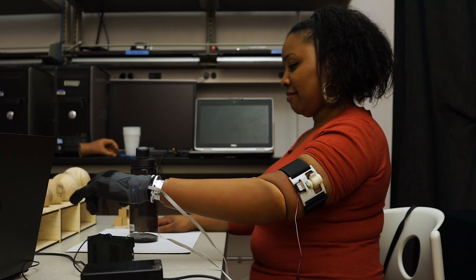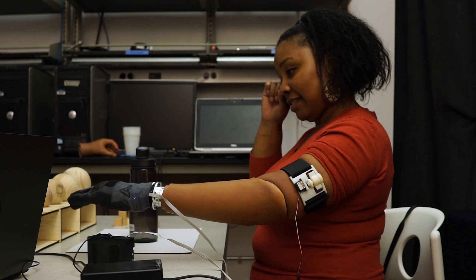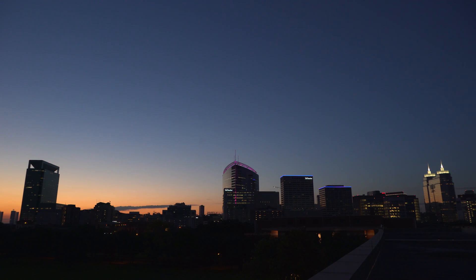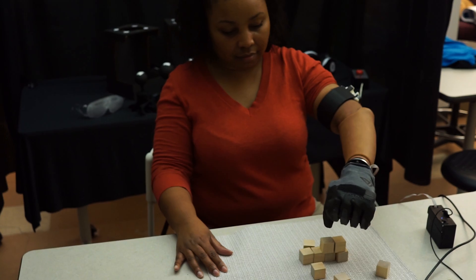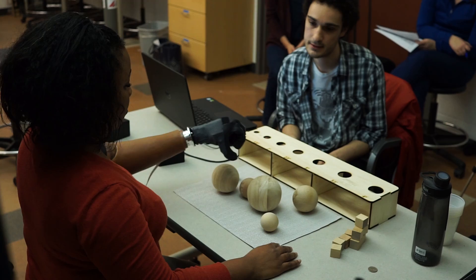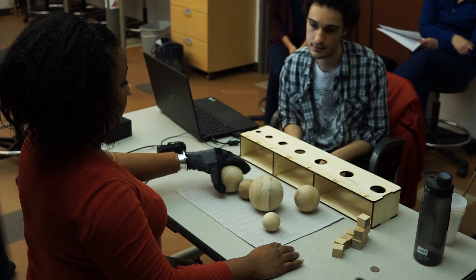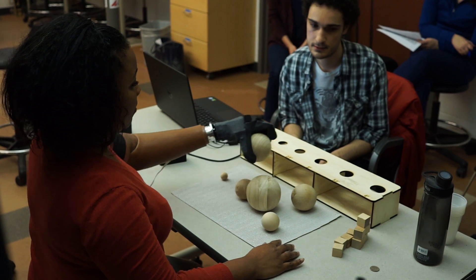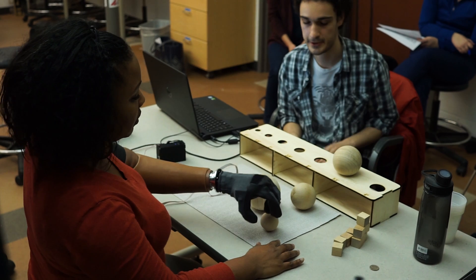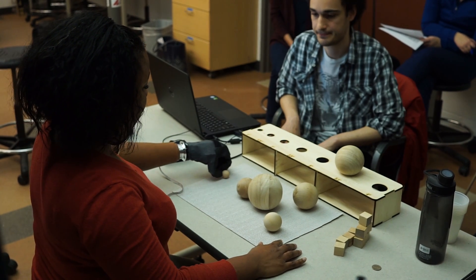One of the things that makes the research in the Mahi Lab unique is that we involve end users from the very beginning — from the design and concept stage all the way to testing and evaluation of our systems. We're able to, with our close collaborations in the medical center, have those interactions with end users, physical therapists, and doctors throughout our design and evaluation process. What's really rewarding is to bring them in at the end and see not just the scientific results of the experiments, but their emotional reaction to having these capabilities and being able to work with the technology.